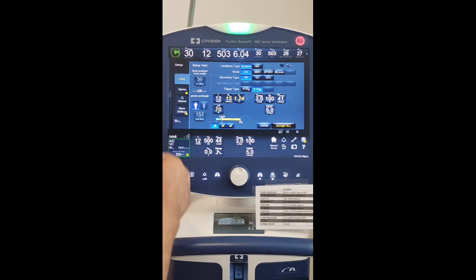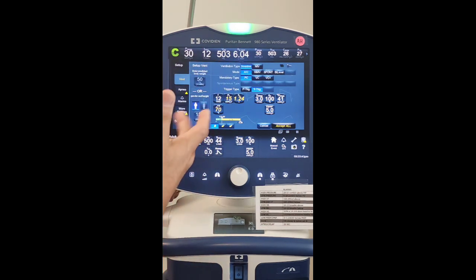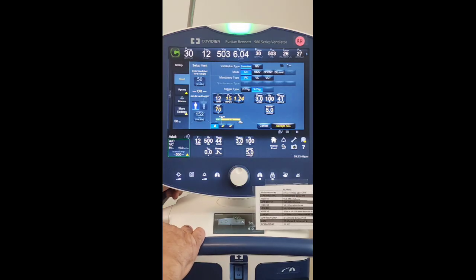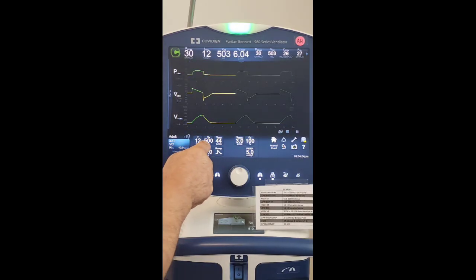The smaller the percentage, the longer it's going to take to get in. So that's going to be patient comfort, and you're going to have to watch the patient. We'll learn about some of that later on, but we'll leave it at default 70%, and leave that as well with your other ventilators, whatever the percentage is when it's the slope. We just leave it there.